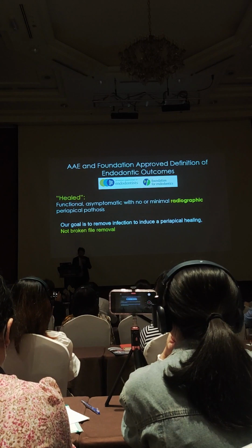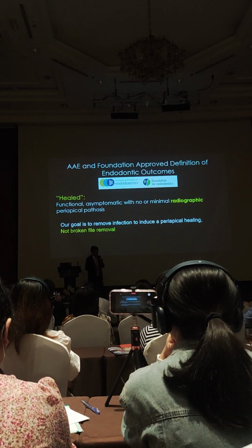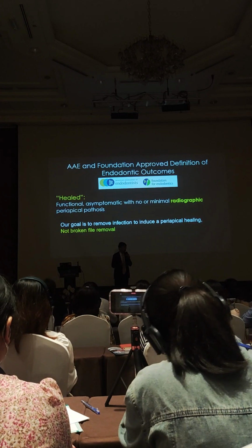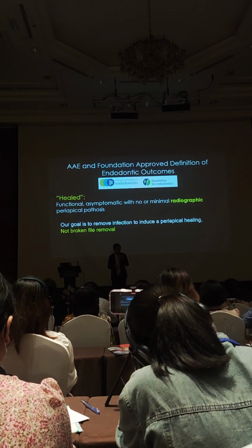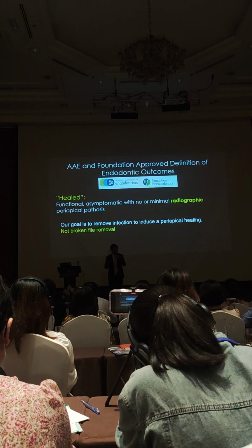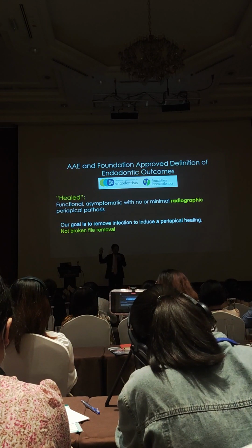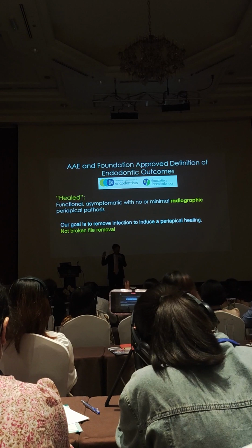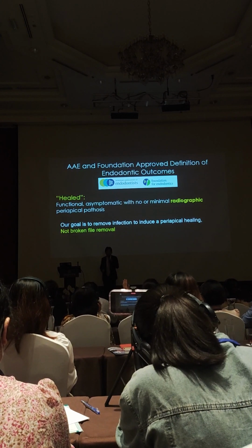So that's why you need to take a radiograph or CBCT, but CBCT is better because CBCT shows more lesions than a 2D radiograph. How many of you have CBCT in this room? Please raise your hand. 3? Only 3? 5? Maybe 10? Okay, thank you.